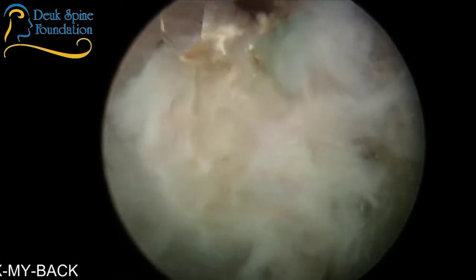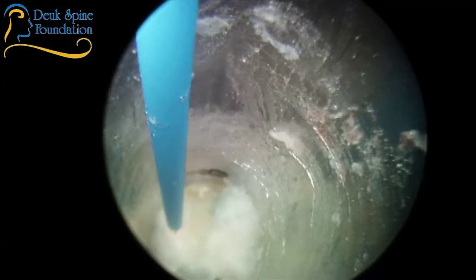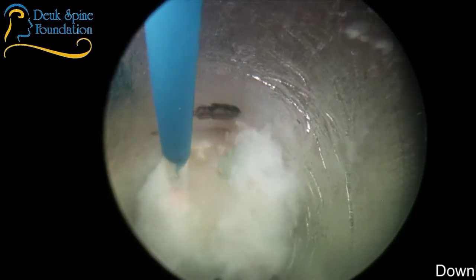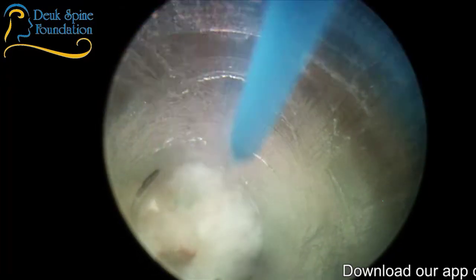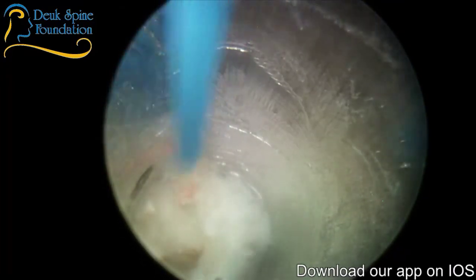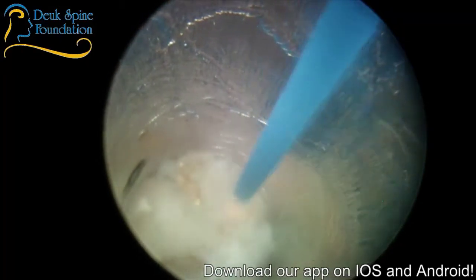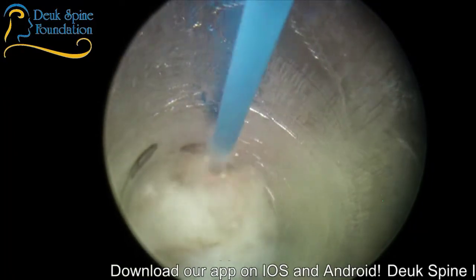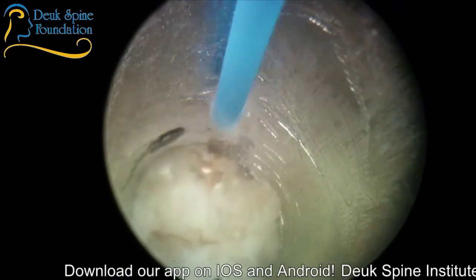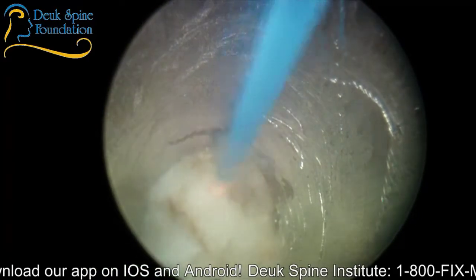Man, this is hard right here. L5-S1's tough, huh? It's always tough. We were just talking about the L5-S1 disc is the hardest disc to fix in the lumbar spine because of the angle that it projects out to on the skin surface is very, very high up towards their ribs and thoracic area.